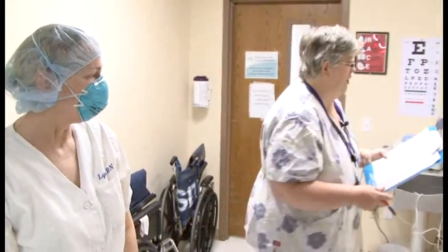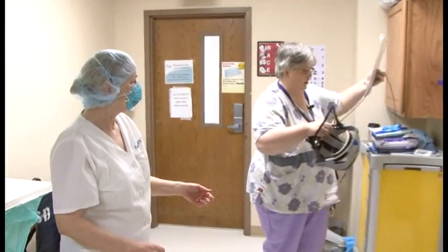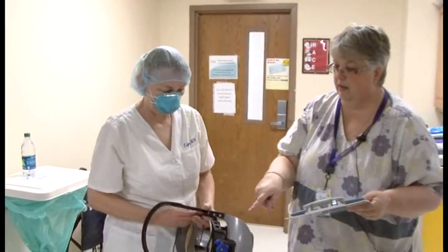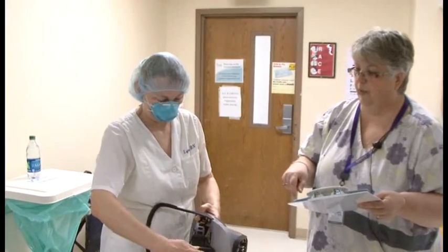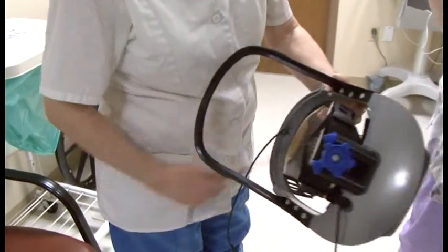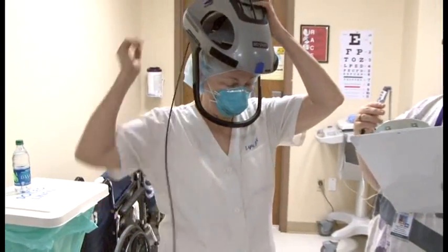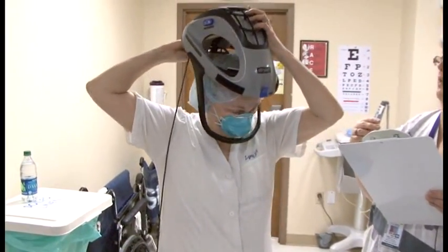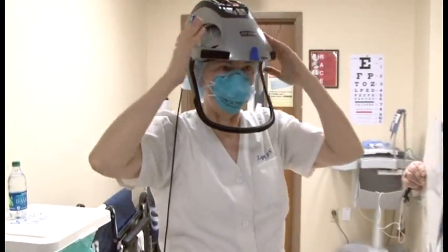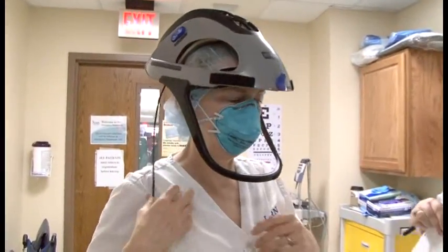Next, Lynn is going to put on her surgical helmet. On the back there is a knob that you loosen before you put it on your head, and then tighten to fit securely. Lynn puts it on, loosens the knob, gets it on her head, then tightens it. She then shakes her head back and forth to confirm it is secure.